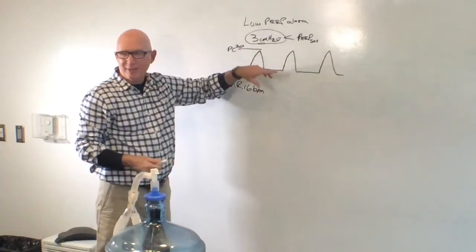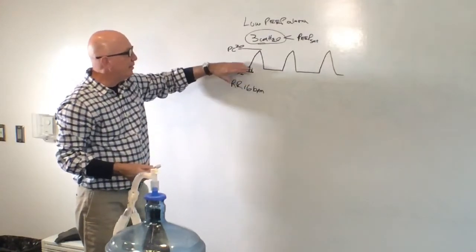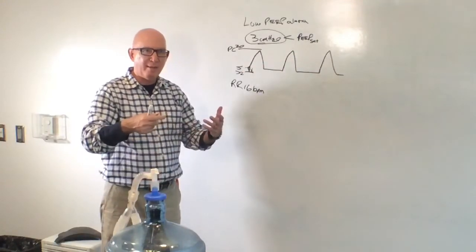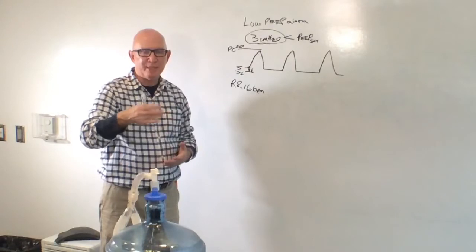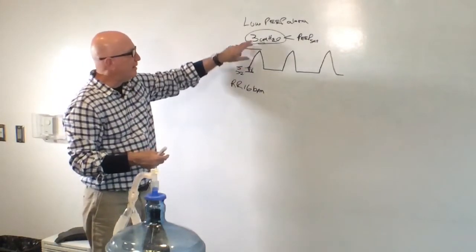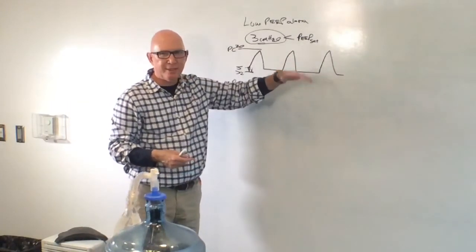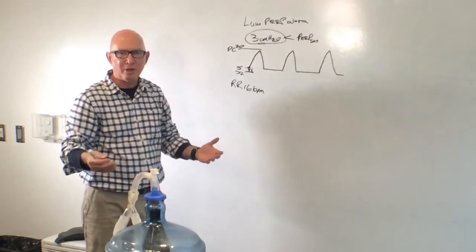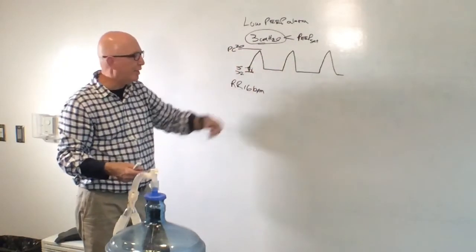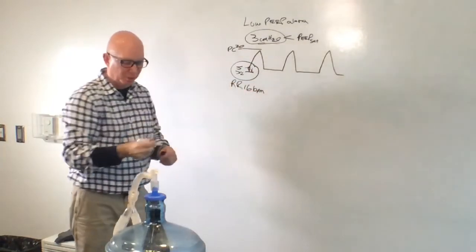I had a question exactly like this for a patient that was exhibiting Cheyne-Stokes respiration. During the apneic period, things worked fine. When the patient began their aggressive inspiratory efforts at the beginning of that respiratory pattern, that's characteristic of Cheyne-Stokes, that's when they exceeded the flow of the ventilator and the low PEEP alarm was triggered. As their tidal volumes and their effort deteriorate, they're no longer triggering the alarm at that point. But the next time they start that whole cycle, they go right back to that same thing once more. And the one way around this is because this is typically a nuisance alarm.